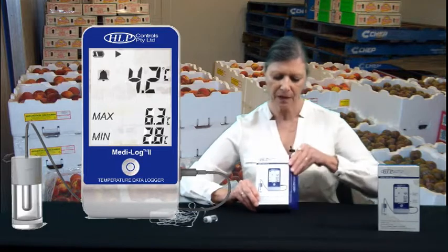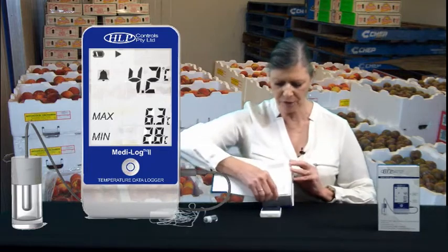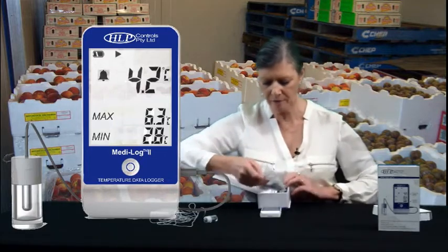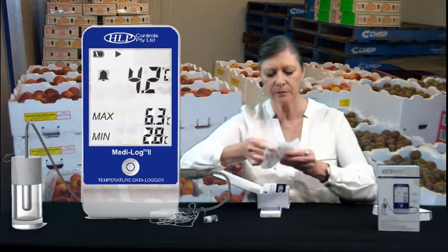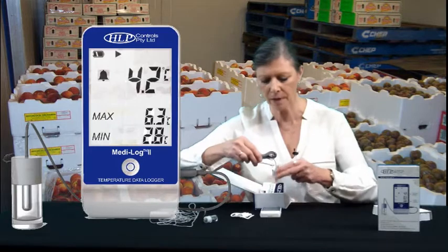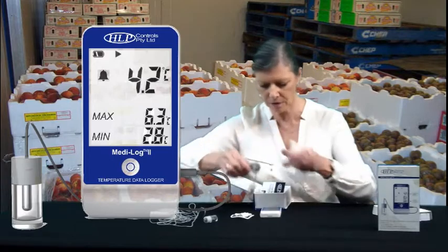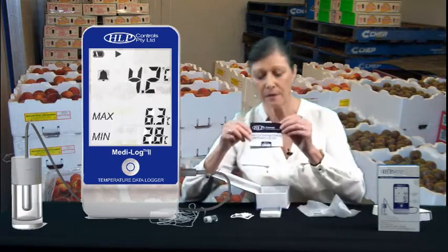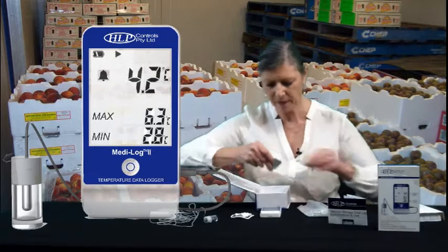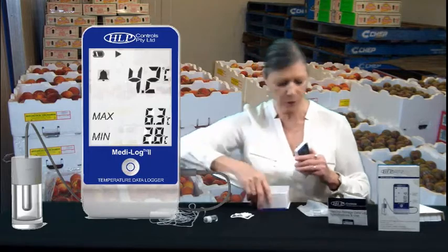Now, what you get in the box — you get the MediLog2 unit itself. You have a bag which contains the USB cable for setting up and downloading your logger, and also the sensor cable and the sensor itself, which plugs into the side of the unit. You also have the manual for how to use the unit, a certificate of calibration, and a hook and loop fastener piece that you can use to mount the unit when you're ready to.